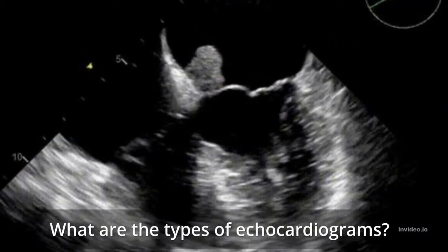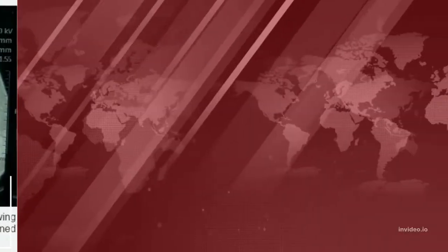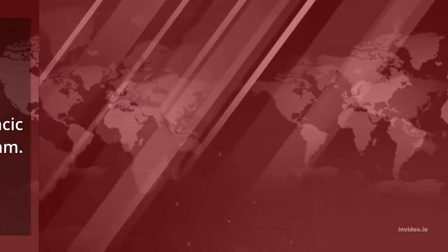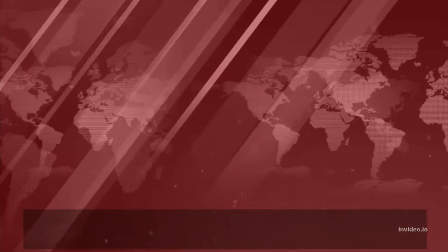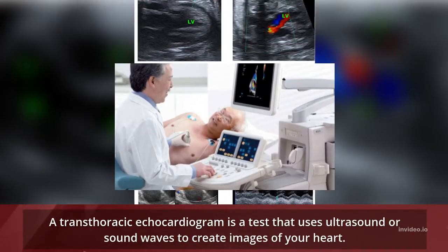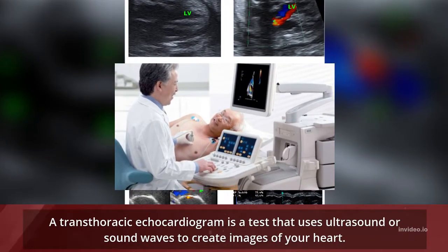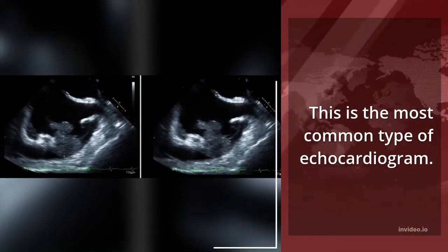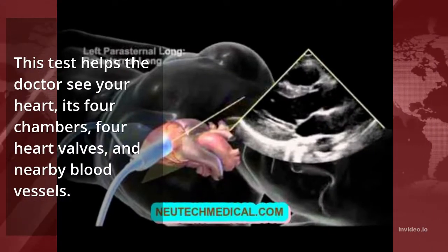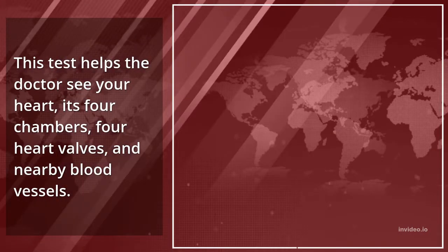What are the types of echocardiograms? There are several types. A transthoracic echocardiogram is a test that uses ultrasound, or sound waves, to create images of your heart. This is the most common type of echocardiogram. This test helps the doctor see your heart, its four chambers, four heart valves, and nearby blood vessels.